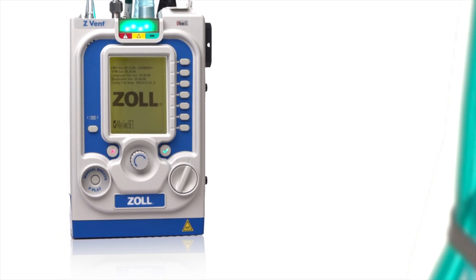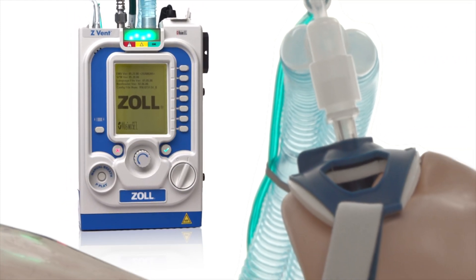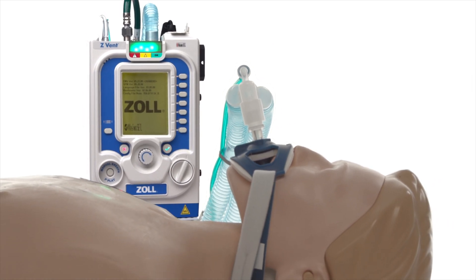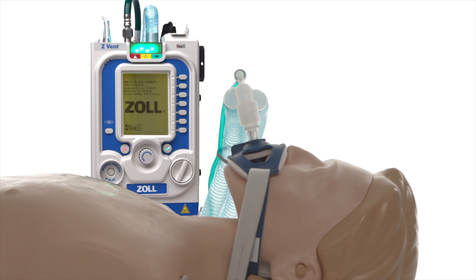We have now completely reviewed the exterior of the ventilator. Throughout the other modules, we will continue to explore the device's functionality and how to prepare the ventilator for use.